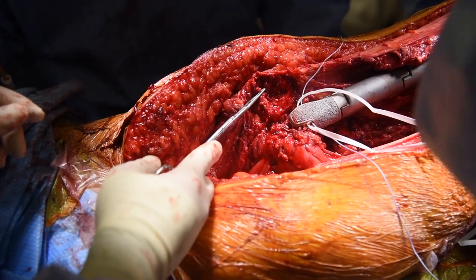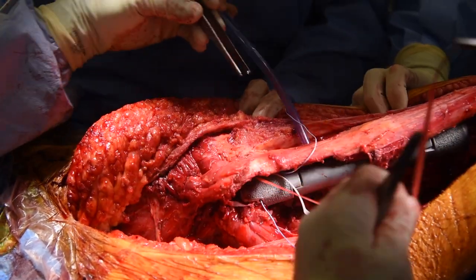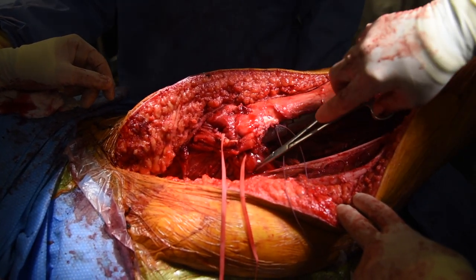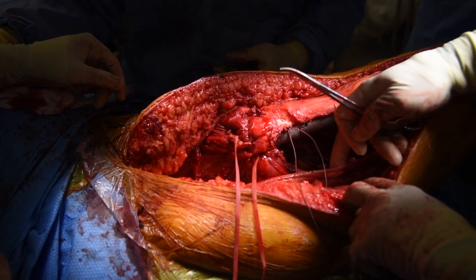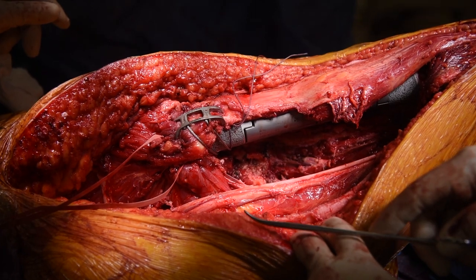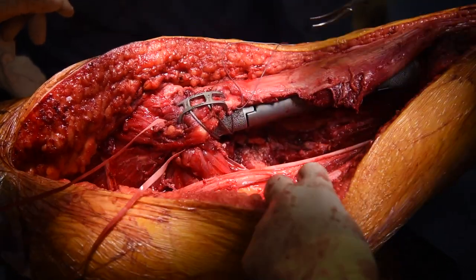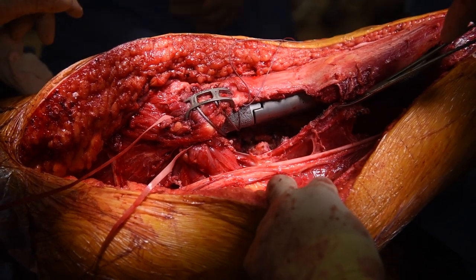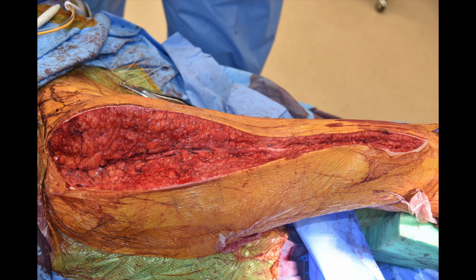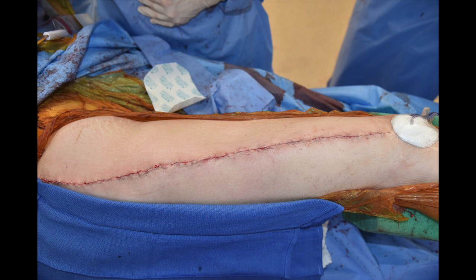We are reconstructing the hip abductor muscles by preserving the greater trochanter and weaving sutures through it and through the abductor muscles, tying it down tightly. We then placed the greater trochanteric claw and fastened it down with cable, holding it in place. We rotated the gluteus maximus and tensor fascia latae over each other for complete coverage, then brought up the adductor muscles and sutured the vastus lateralis in place. Further closure was performed in a layered fashion with number-one Vicryl for deep tissue, 2-0 Monocryl for subcutaneous tissue, and a running 3-0 Monocryl subcuticular stitch.